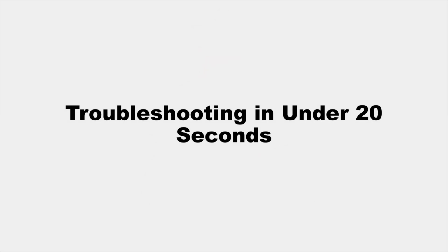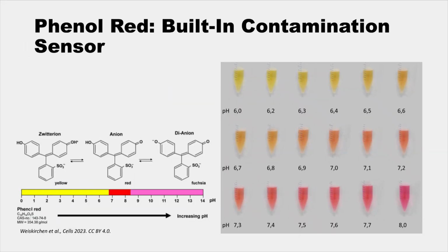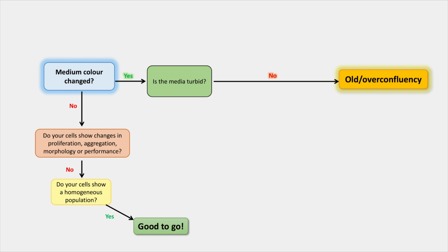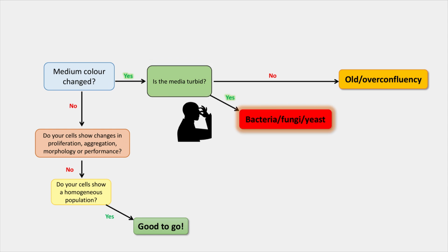Let's troubleshoot fast. Your first clue is the color of the medium. It contains phenol red. Under normal conditions it looks like this, but it turns yellow when acidic, and pink when basic. So the first question is, did the medium's color change? If not, and your cells look happy and healthy, then everything is fine. If it did, but you know your cells are old, and anyway the media is clear, it's probably just a pH shift, not contamination. If the medium changes color, turns turbid, and smells off, you're dealing with microbial contamination.